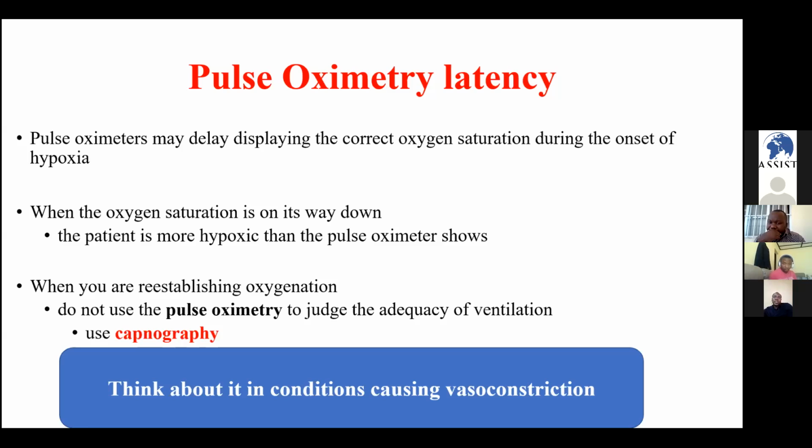So in this scenario, what is recommended is to pre-oxygenate your patient while you are going to intubate. And once you have placed the endotracheal tube, in the first 120 seconds, when the saturation is down, you cannot conclude that you have failed your intubation.